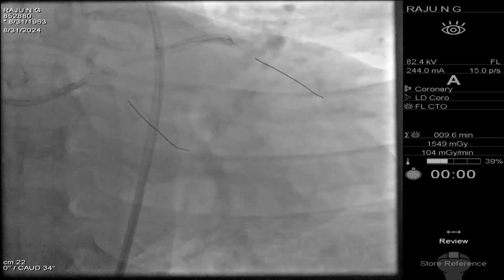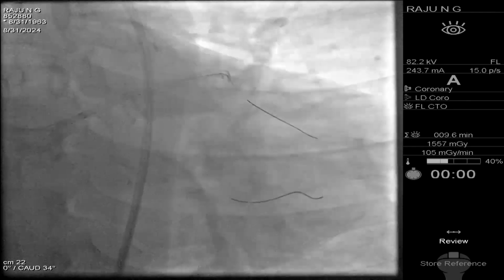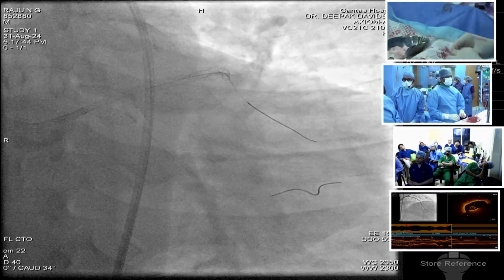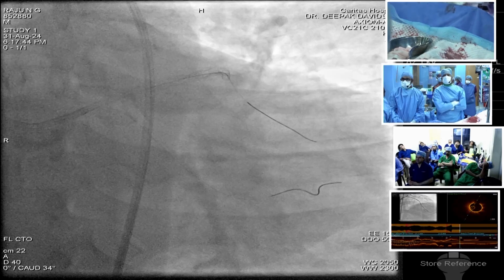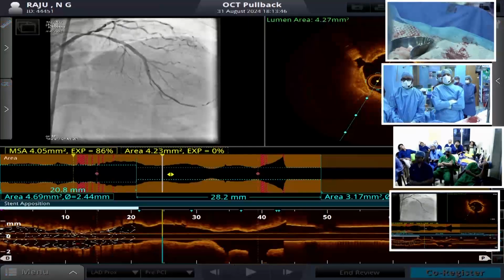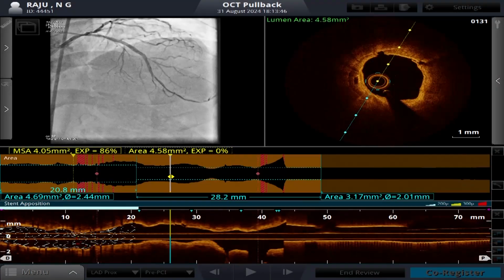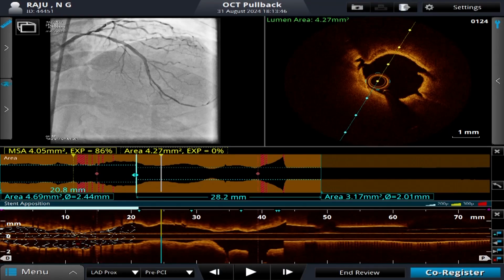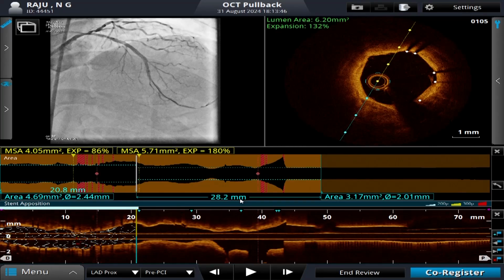Okay. Come more proximally, come more proximally, come into the guide catheter, at least 5 millimeter into the guide catheter. Come more proximally. Okay, leave it there. What about the other marker? No, the other marker, distal marker. We need to assess the length of the lesion area, length of the lesion. Green marker area. Green marker. Okay, there. Okay, so it's 28 millimeter.